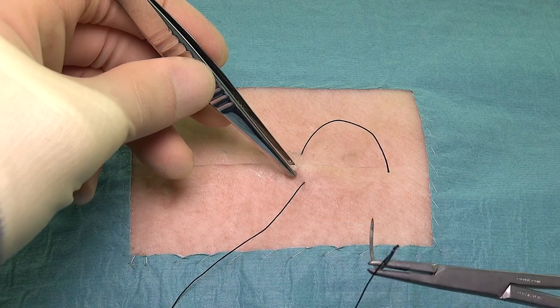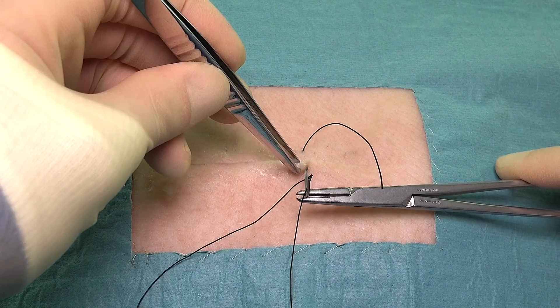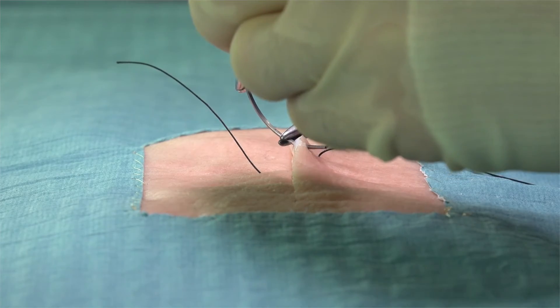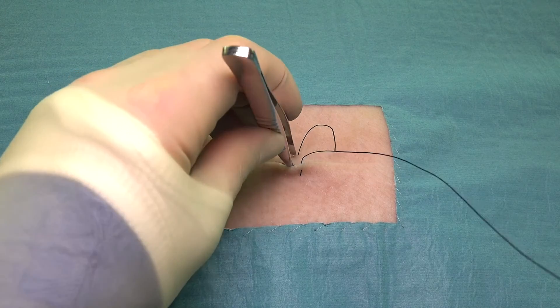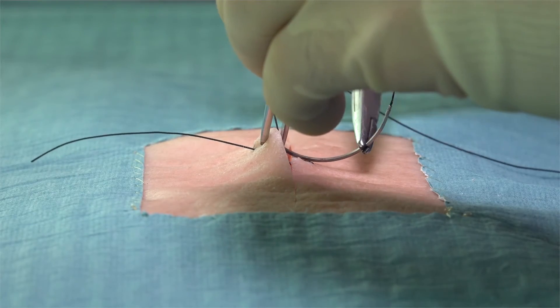The needle is then reversed and using a backhand technique, the needle is passed much closer to the wound edge. Again, we should be aiming to keep the same distance from the skin edges with these smaller bites.